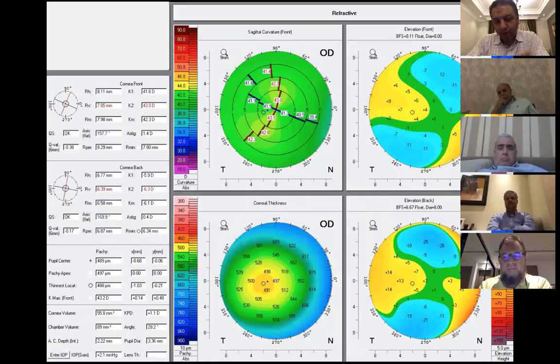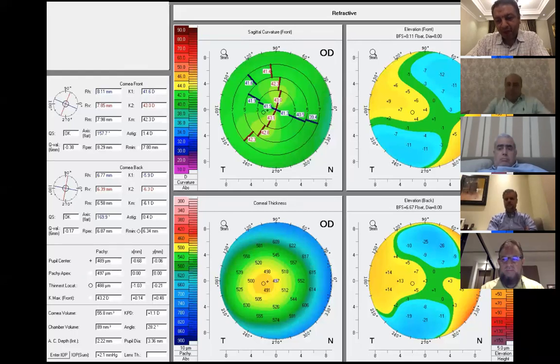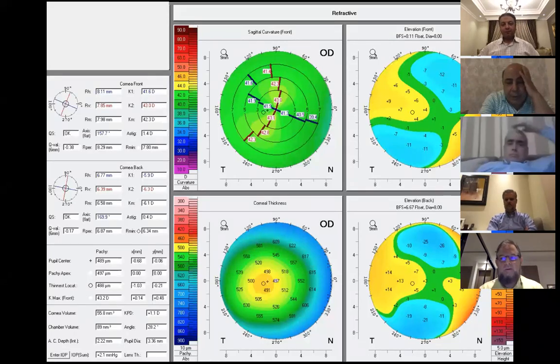PRK is excluded because of the unsatisfactory results after PRK in hyperopic patients. But I will do the same for the femto flap and correct +5, not +6. Remember, this is a hyperopic patient of presbyopic age.